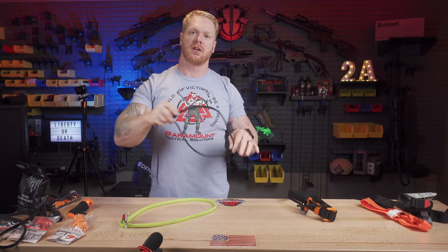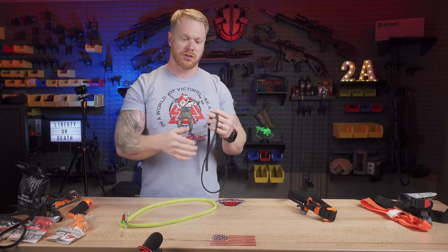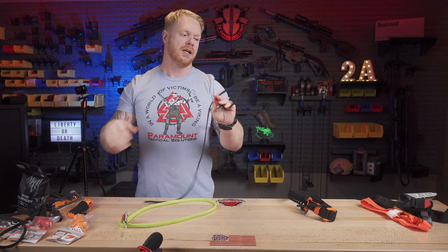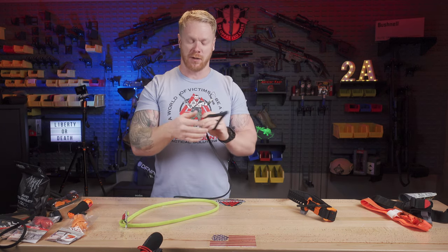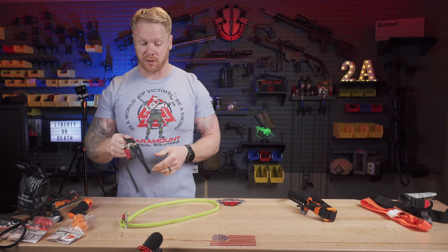The other thing that's great about this tourniquet — unlike many others — is that this is one of the few you can actually use on pediatric patients: infants, small children, as well as animals. We have a lot of canine units that carry these for their dogs. It can be used on strangely shaped limbs, like a dog leg. These are very versatile, and it's one of the reasons I carry these on my person at all times.